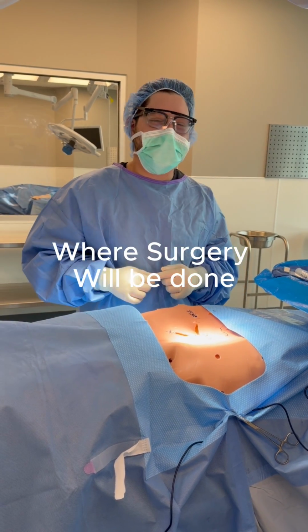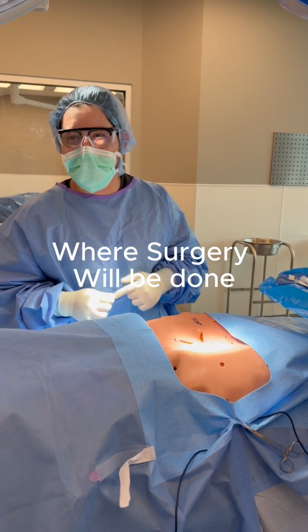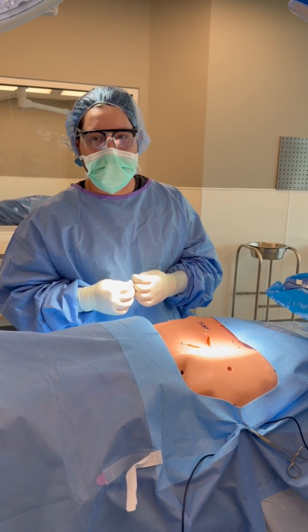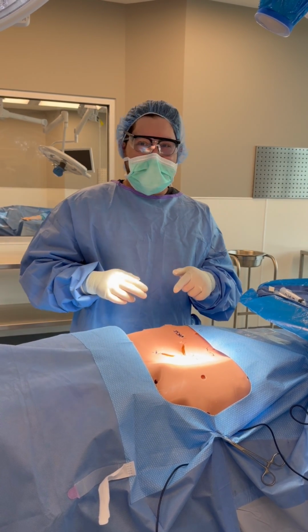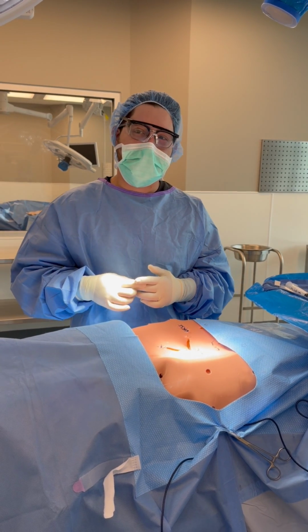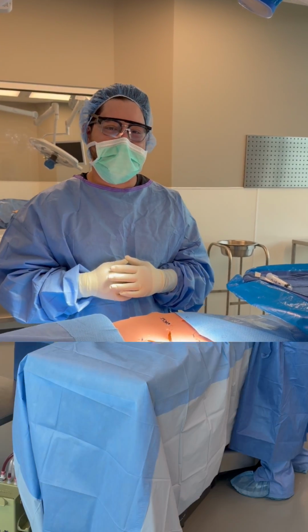Alright, so today we are doing a total abdominal hysterectomy. I will be making a midline incision. We could also do a Pfannenstiel incision, but I will be doing a midline for more exposure and visibility for the surgeon. We will also be removing the uterus and the cervix. I will also be assisting the surgeon by retracting, suction, and closing the patient.